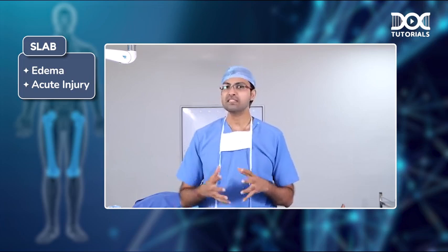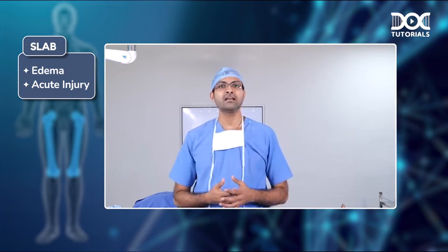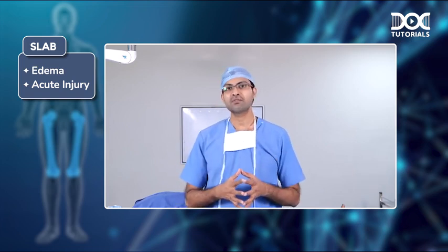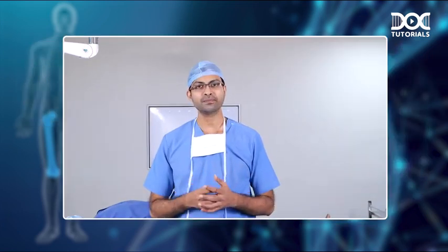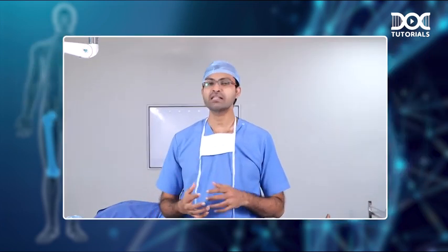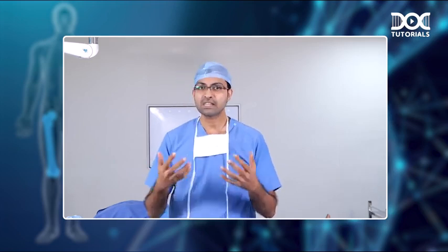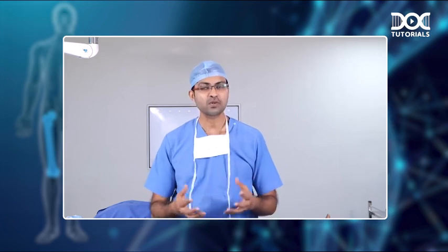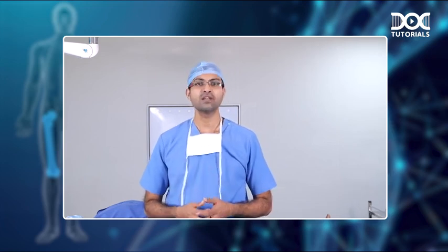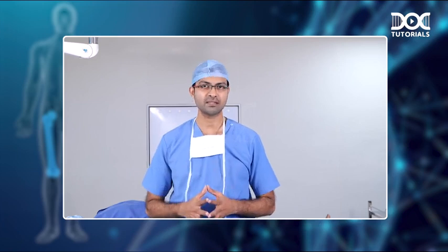So, the advantage here is that even if there is swelling because of the acute injury, there will not be any constriction effect and there is no risk of vascular damage to the limb. If you put a cast in an acute setting, there is a risk that after a few hours, it can increase the edema and cause compartment syndrome and other such complications. So always in the setting of an acute injury, apply a plaster of Paris slab.